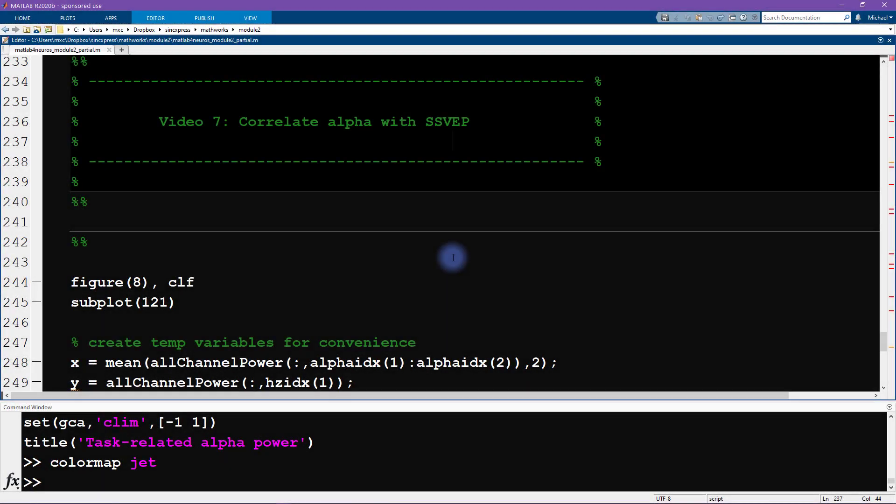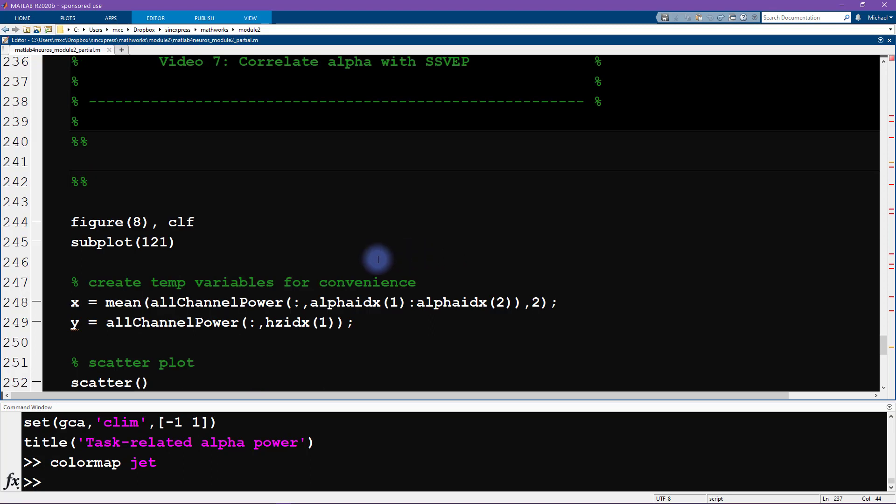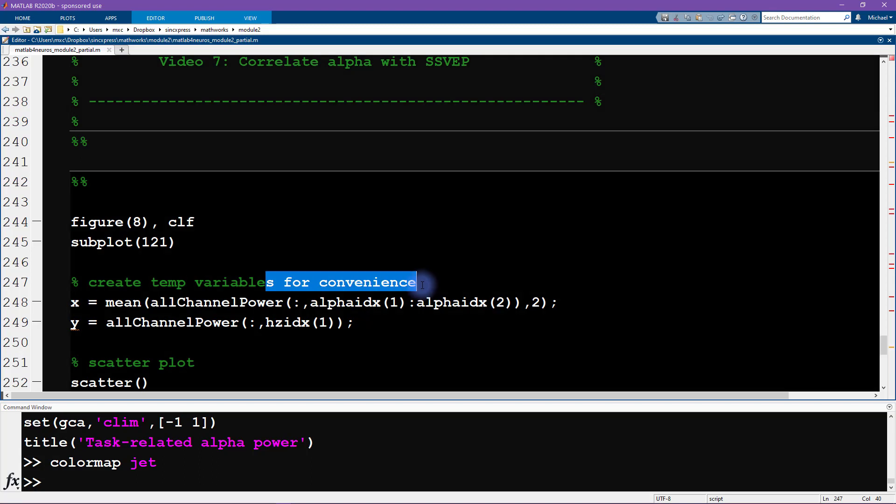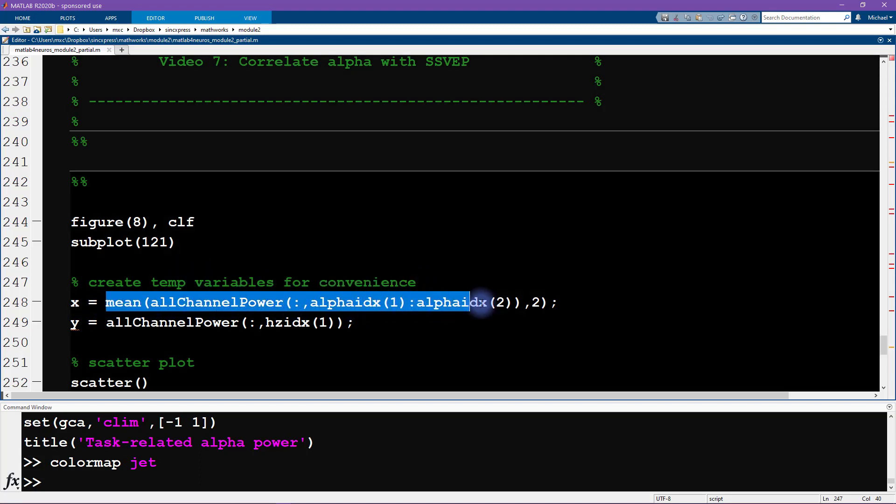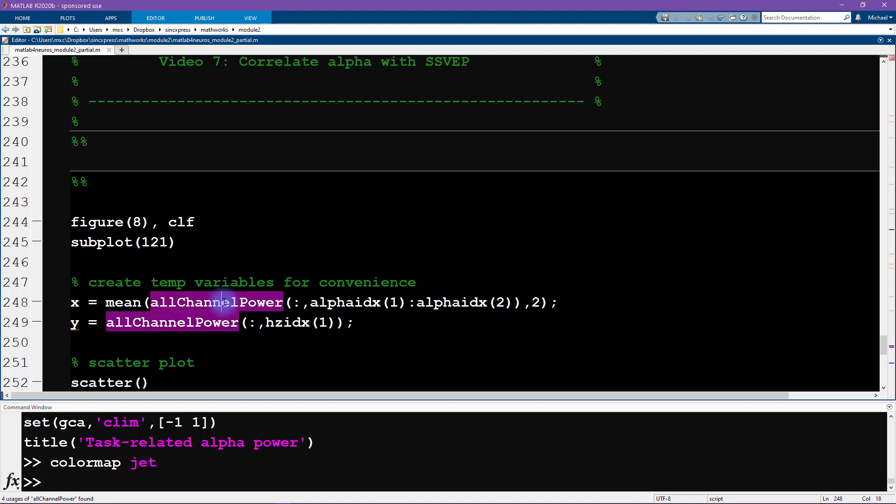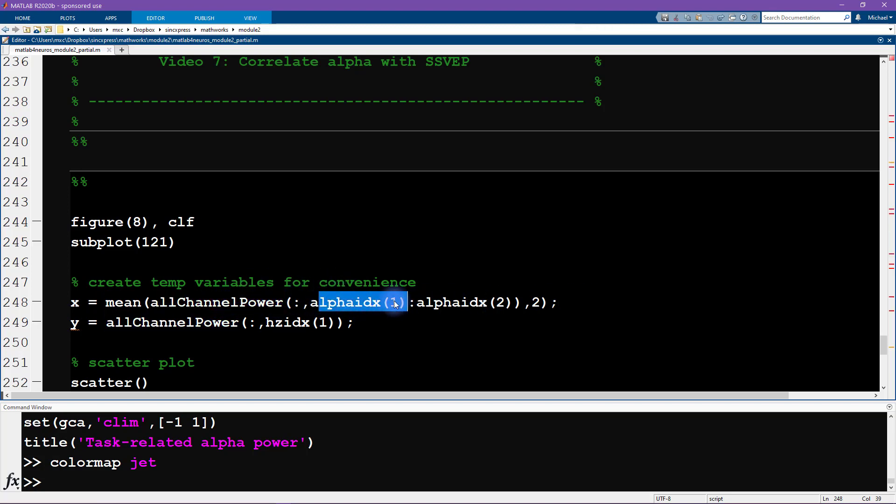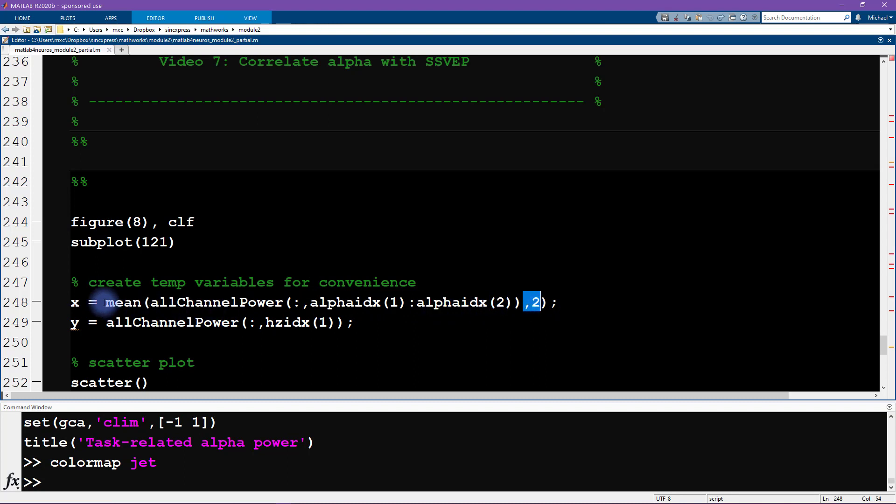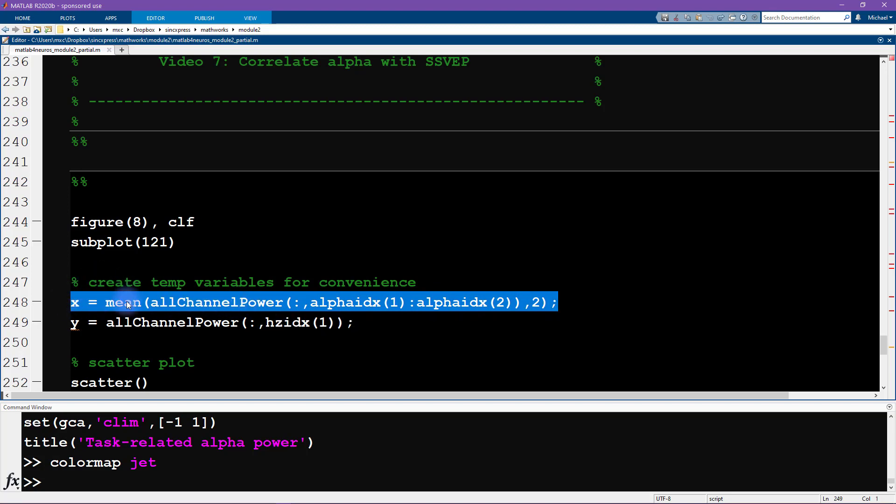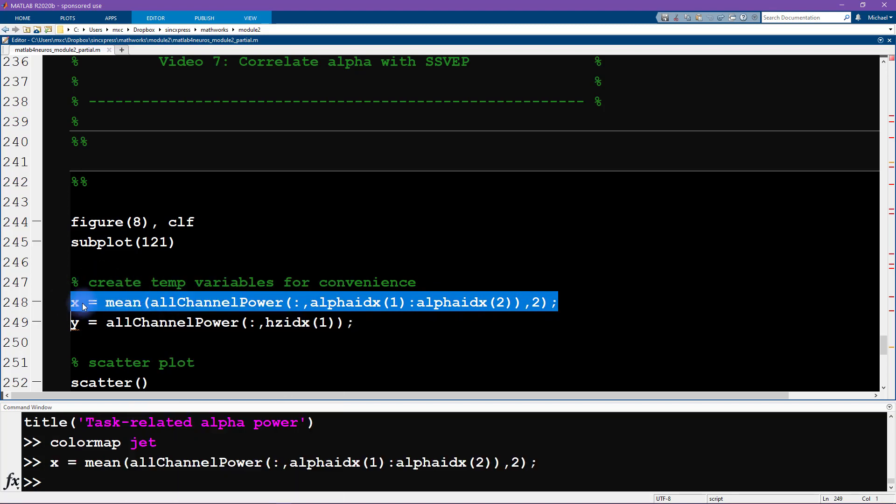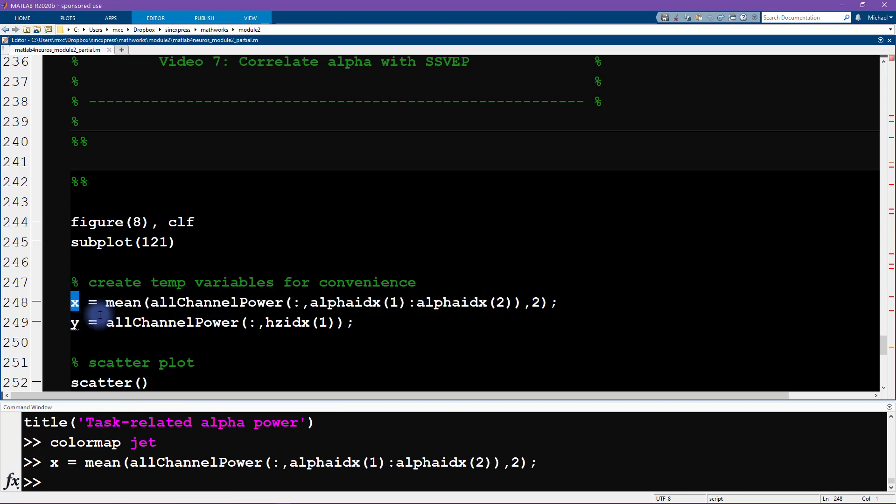Now it's time to switch to MATLAB and start coding. We have already created all the data that we need to use in this video, however it is sometimes useful to create new variables for convenience from other variables. Here I have this relatively long line of code that says the channel power for all the channels, and we want from this frequency to this frequency, and then we're averaging over frequencies. This is a pretty long line of code, so I'm just going to call it all x.